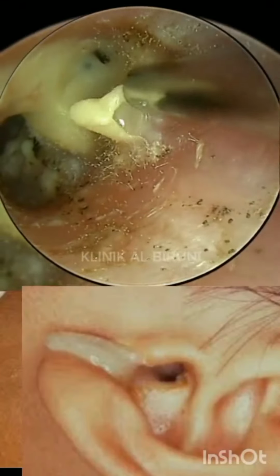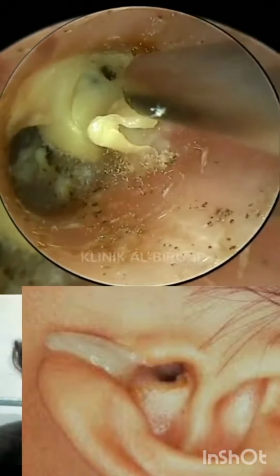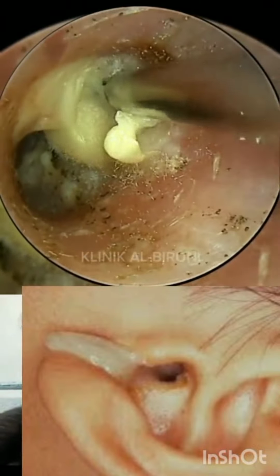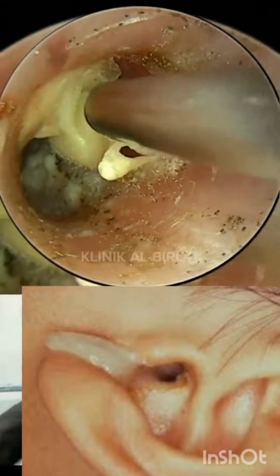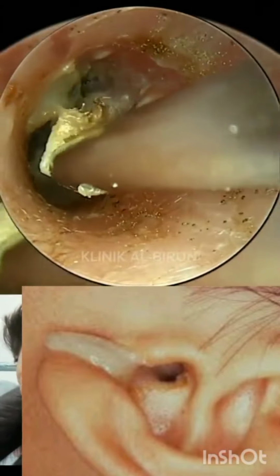So to remove this effectively, you should be suctioning it. You suck it with a vacuum. It should be done by an ENT specialist, and you should be careful not to damage the eardrum. So this is how we suck it out gently.